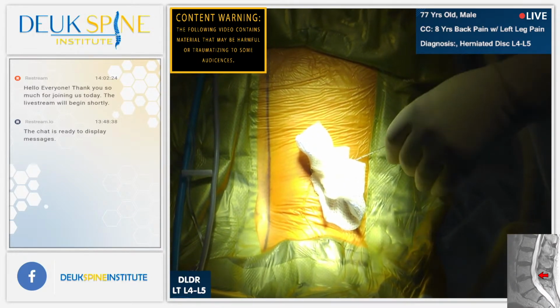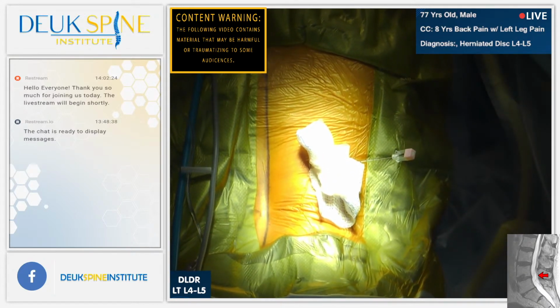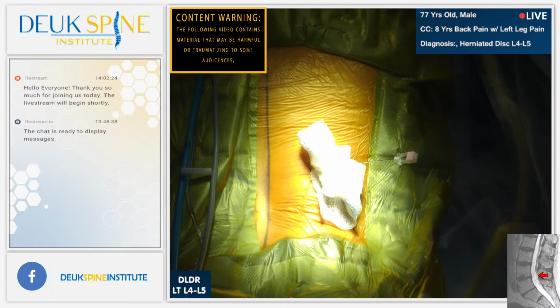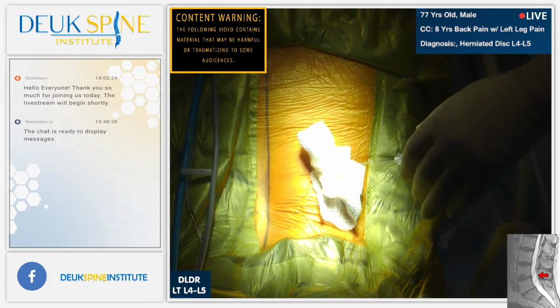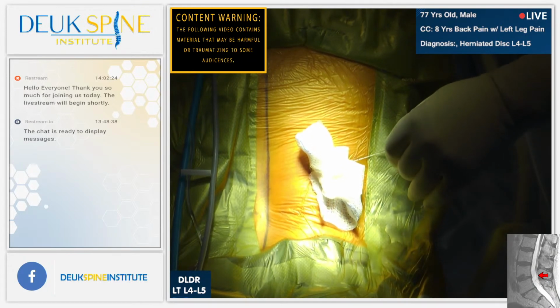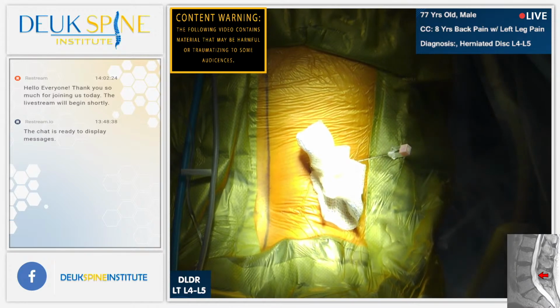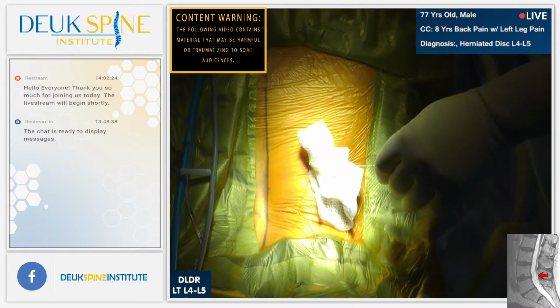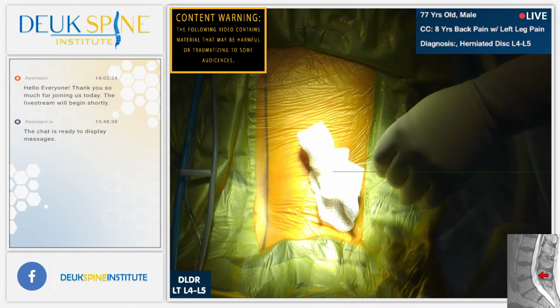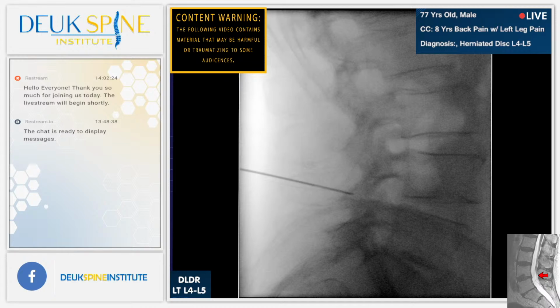All right. We're going to aim for, lay still. Don't move. A lot of people ask, why do you keep the patients awake for the surgery? We don't. We keep them awake just in the beginning until we get the needle into proper position and then test it. Shot. So you can see we're aiming for the 4-5.